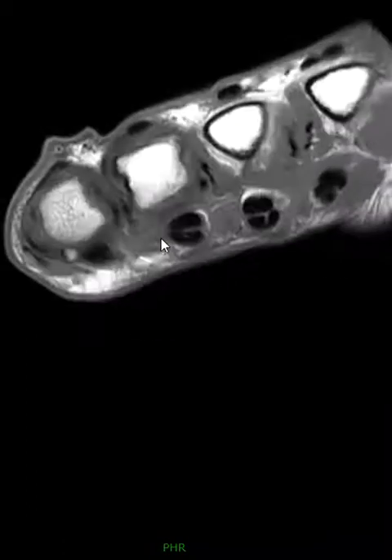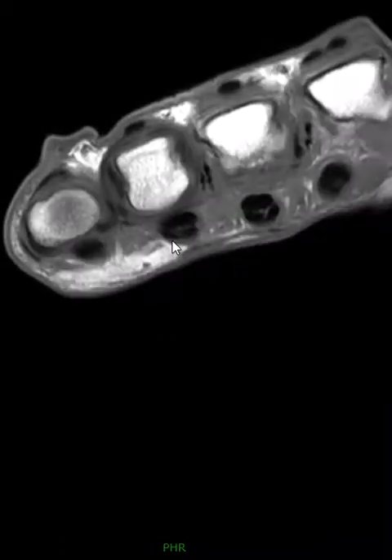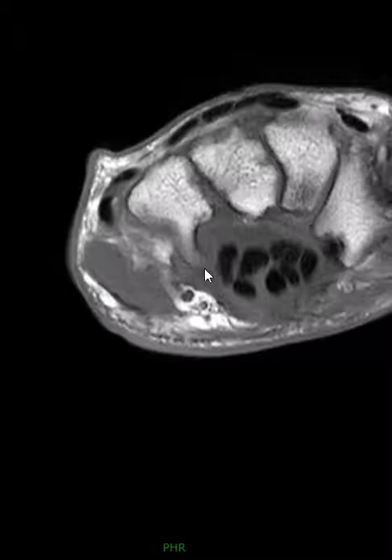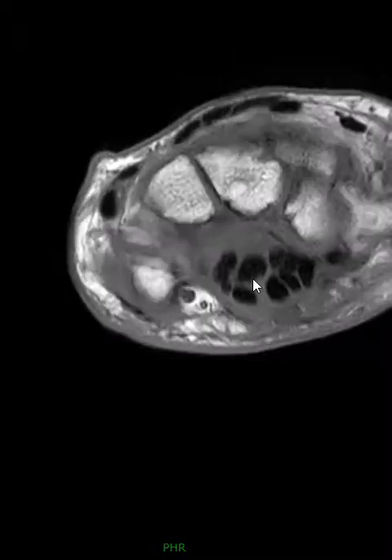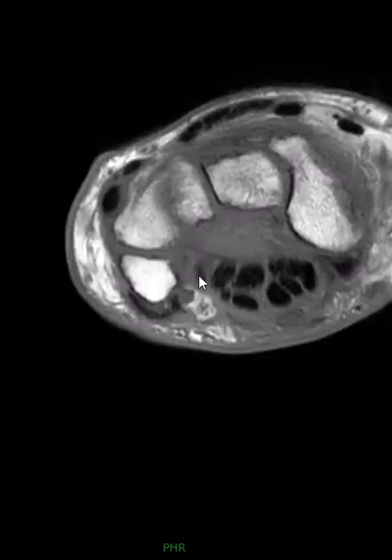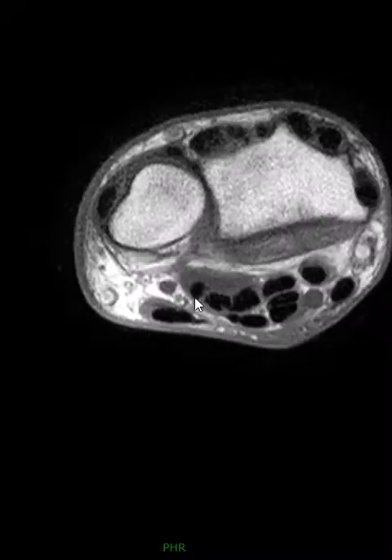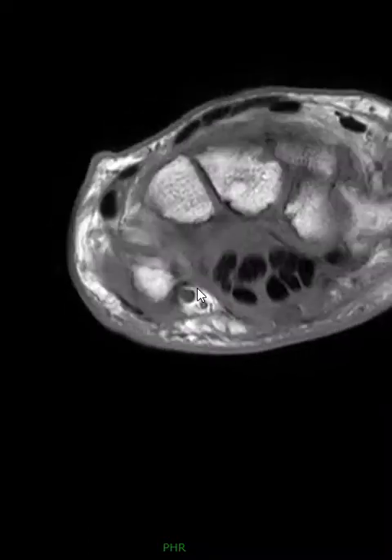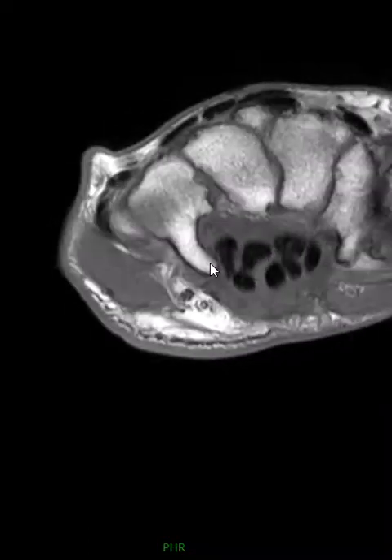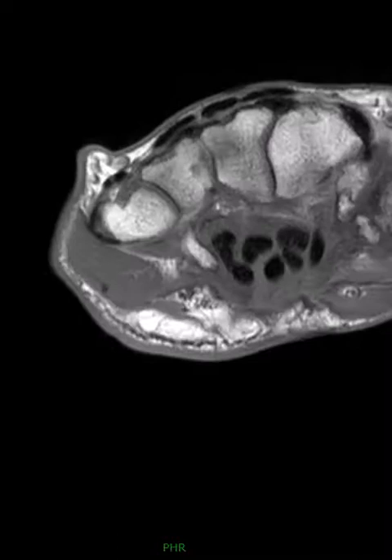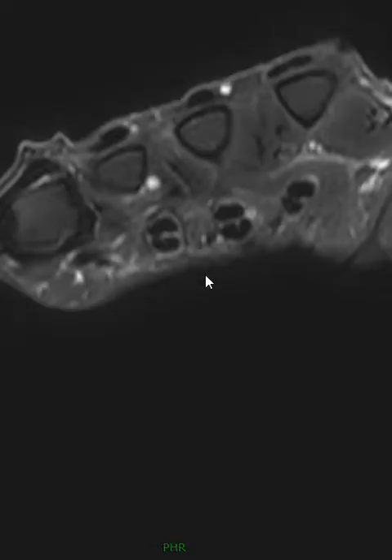If we come down lower into the wrist — here's the hamate — we go down lower and we can see the tendon starting to show back up. There it is right there. Then you roll up, up, up and watch it disappear — gone right there. And then it reappears distally.